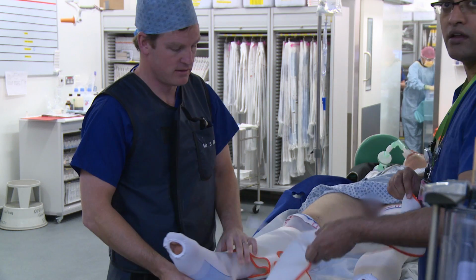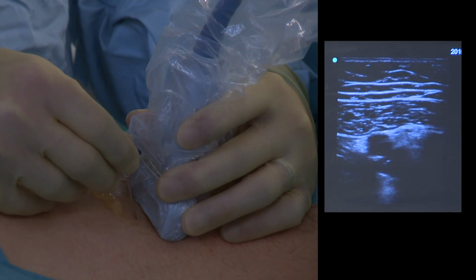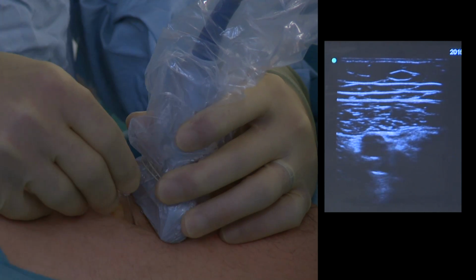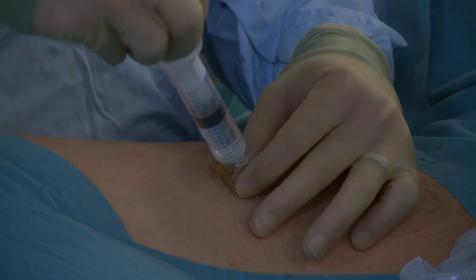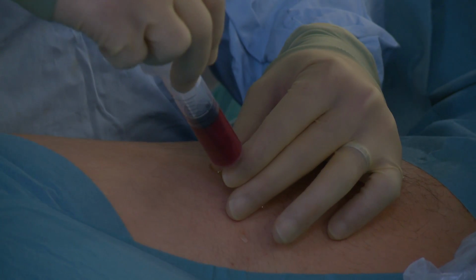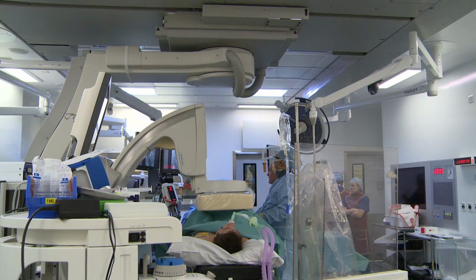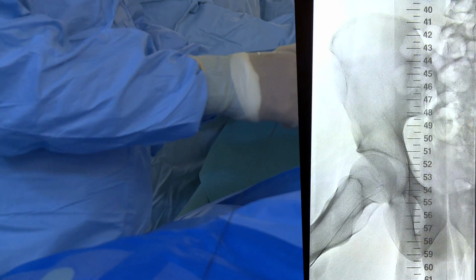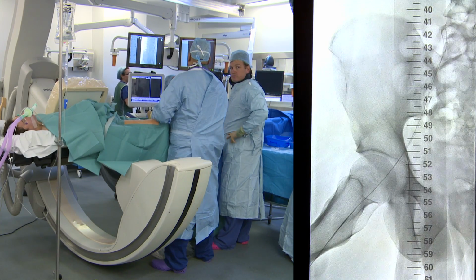Floatron boots and compression stockings are placed before surgery is started. Access is obtained under ultrasound guidance using either the standard Seldinger technique or cut down. A guide wire is advanced through the diseased segment of the vein. The occlusion must be able to be traversed by a guide wire to be able to properly perform the procedure.